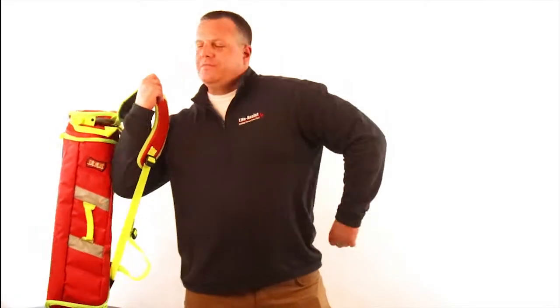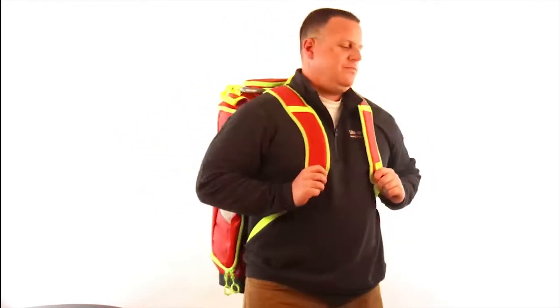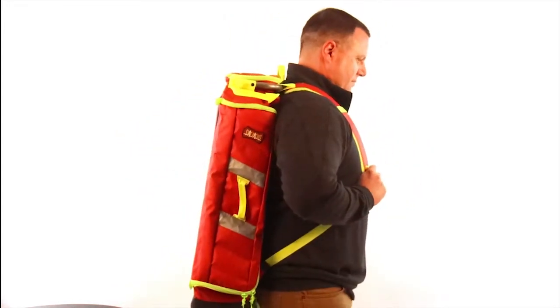The G3 Responder is a larger size bag that affords the user several different configurations, making it highly customizable for your department's needs.